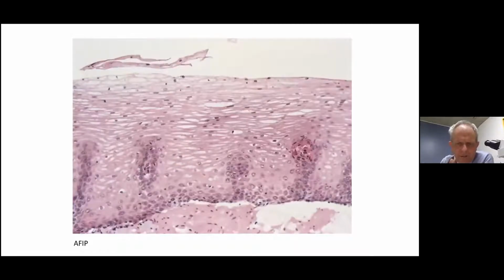So this is usually what we see, and this is a normal picture of an uninflamed normal esophagus. If we start in this region here, we've got the submucosa there. We've got this very thin layer of basal epithelial cells, and these here are vascular papillae, and they are relatively evenly distributed, as one can see. And then the squamous epithelial cells, obviously this is the proliferation zone where you get cell division taking place.